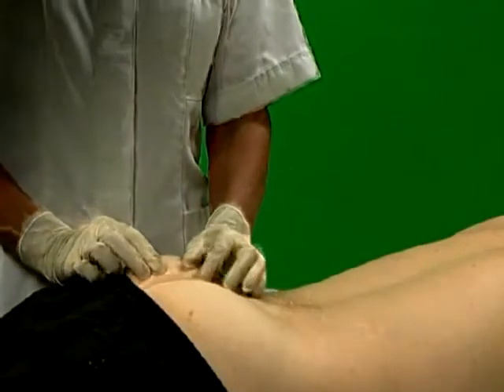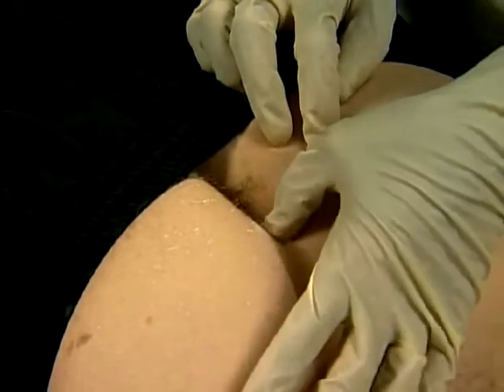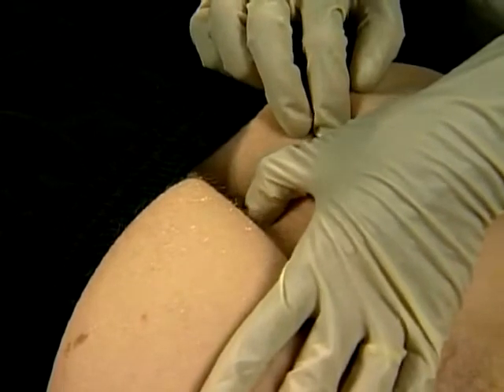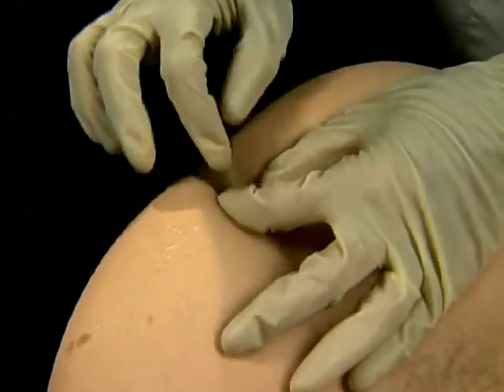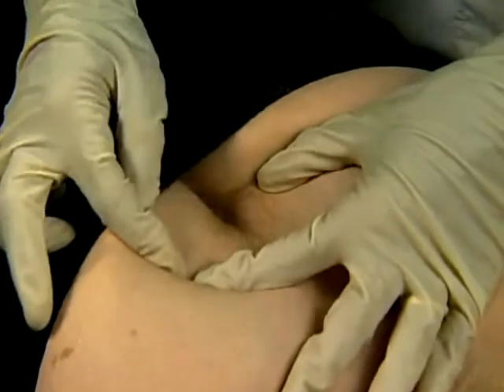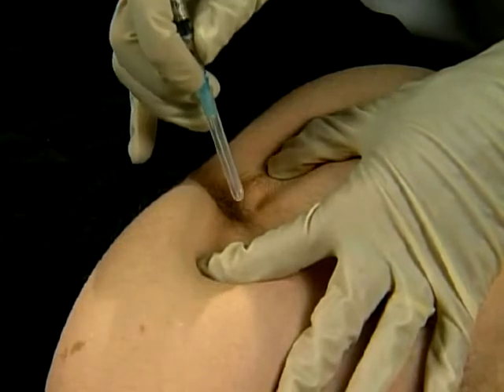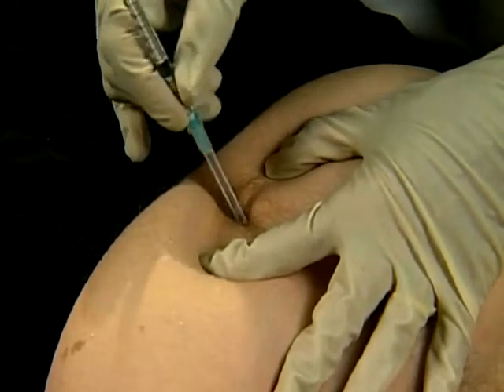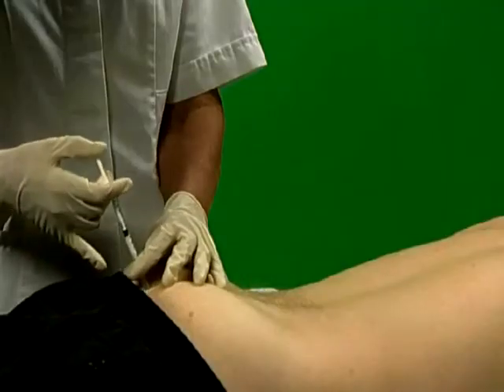Identify the sacral cornua, the 2 little bumps just above the buttock cleft. Move distally to the sacrococcygeal joint line. Mark the entry point, clean and firmly stretch the skin, and rapidly insert needle perpendicularly. Pass down to gently touch bone. Aspirate and pepper around the ligamentous attachments.